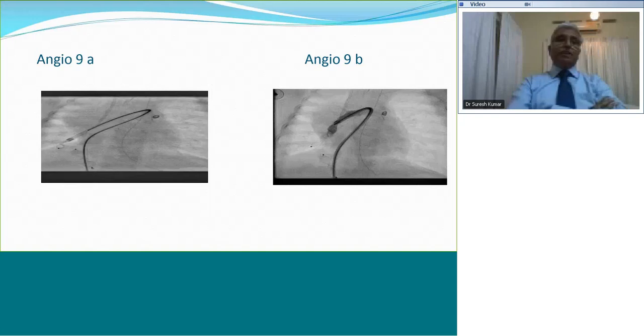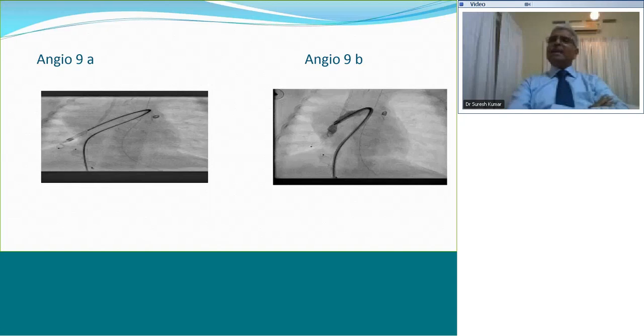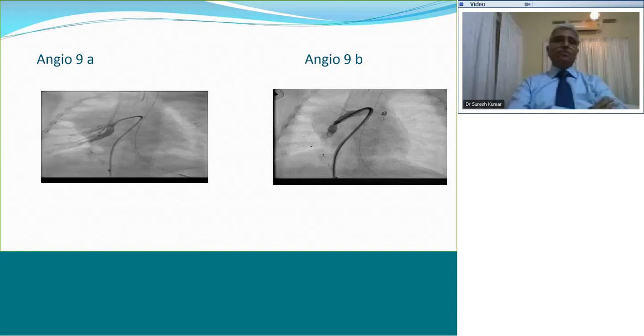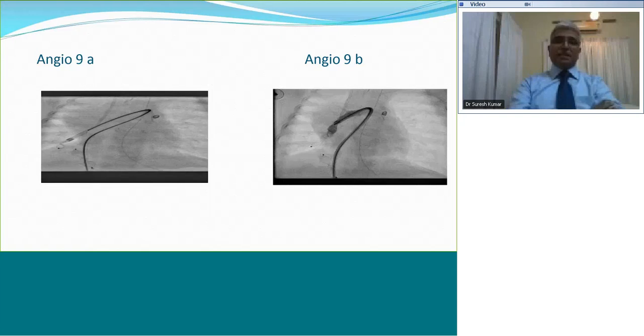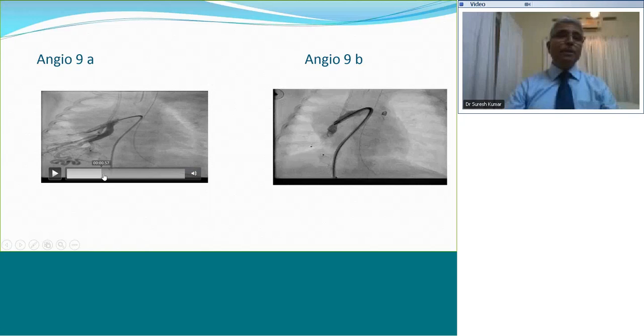Bhargavi, yes, pulmonary arteriovenous malformation. Excellent. Parvesh, pulmonary AV fistula. Okay, both are more or less the same. Akshada is more specific. It's a right pulmonary artery, pulmonary AV malformation. Okay, all of you are right. So what you are seeing, the injection is into the right lower lobe pulmonary artery, and that shows this tortuous vessel. I've stopped the angio at that point so that you can see that vessel.